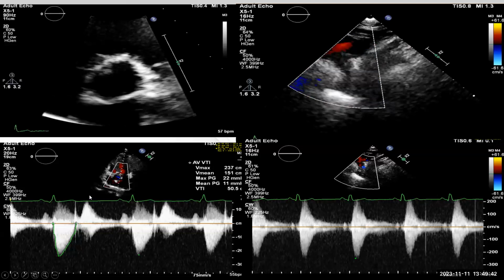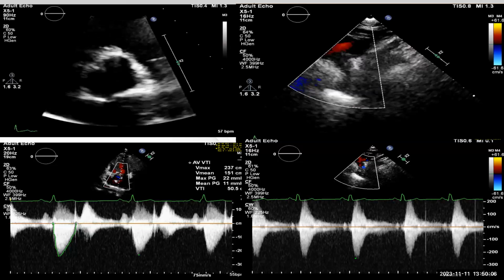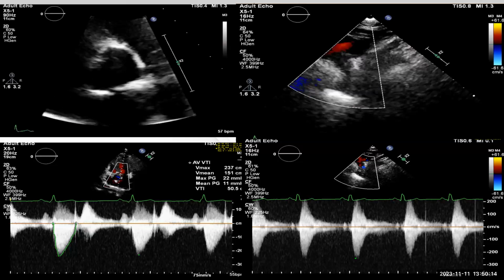Sometimes in the exam, they will not bring you the full picture, or everything, just the diagnosis. They want to know, in a few questions, what your thinking process is for the severity of the lesions. They may bring you just pulse wave, continuous wave, sometimes E velocity, and sometimes maybe a bubble study across the tricuspid valve or contrast across the aortic valve. This is rare, but they may bring it. So the clue is not only color flow. You have other clues here.